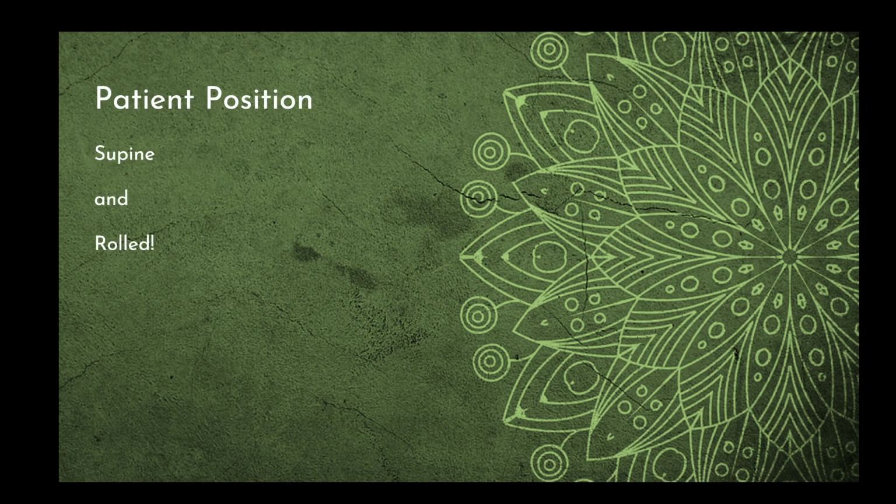Patient position is a very important concept to know with the gallbladder. We usually start the patient out on their back, and that's called supine. And then I like to have them raise their arms above their head, just kind of gets everything out of the way. So now I can scan subcostally or below the ribs, or I can scan intercostally in between the ribs to see the liver and the gallbladder.